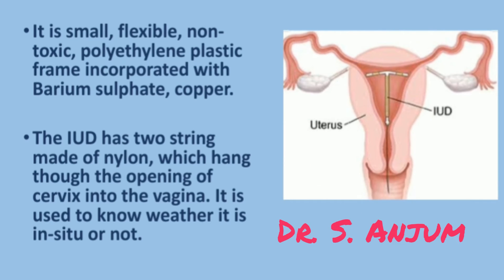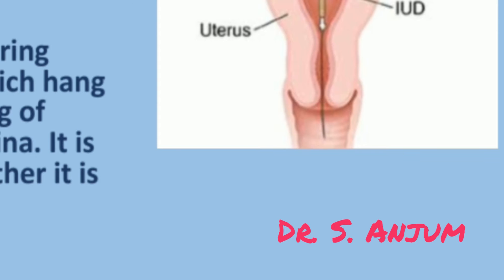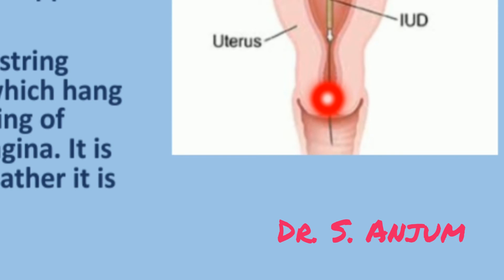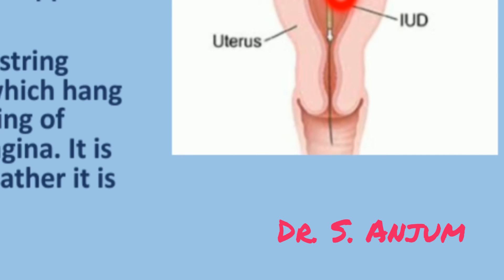This is to confirm whether the IUD is in-situ or not, whether it has been washed out or slipped off. We instruct the patient to check the thread regularly and to inform the nearest doctor immediately if the thread is missing. Sometimes this thread is coiled up high inside the vagina and the patient couldn't find it, but the IUD was actually in-situ. Sometimes it is washed out or slipped out, so it should be confirmed clinically.